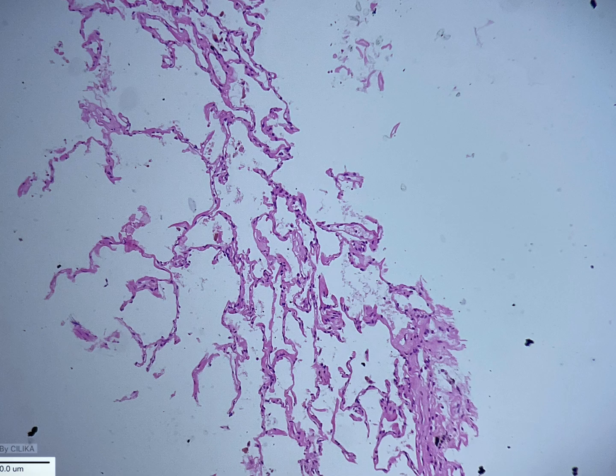This is a picture of normal alveolar structure of lung, though in this case some of the alveoli are hyperinflated and you see some condensation of fibrous connective tissue on one end. Remember that as a pathologist, I rarely get to see normal alveolar tissue.